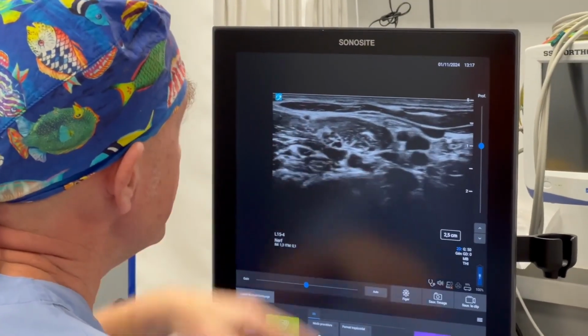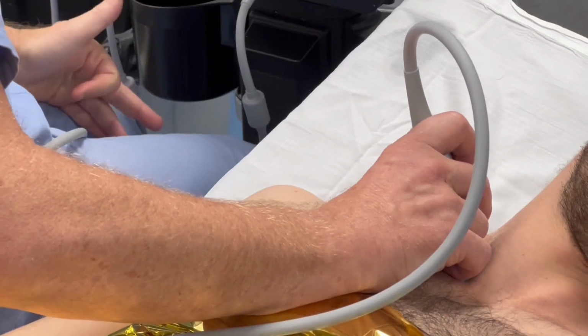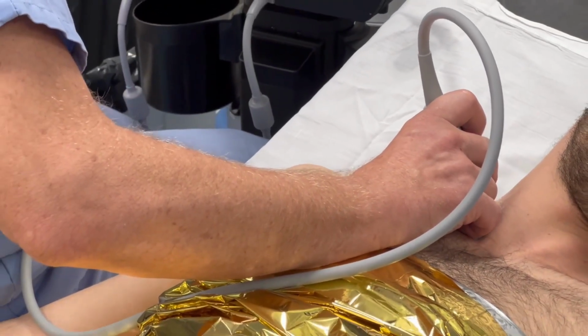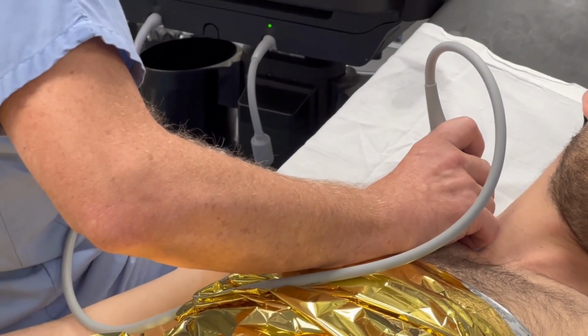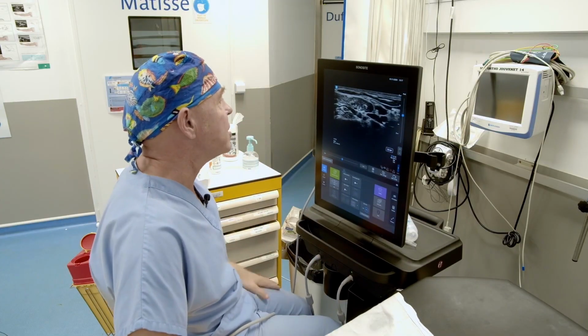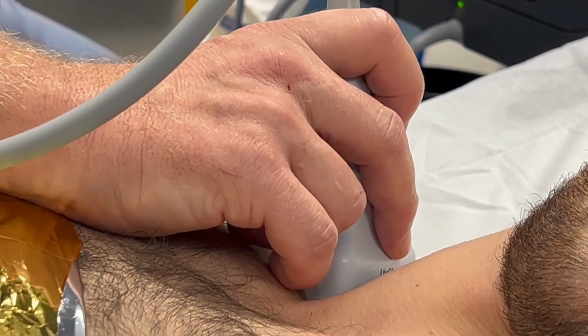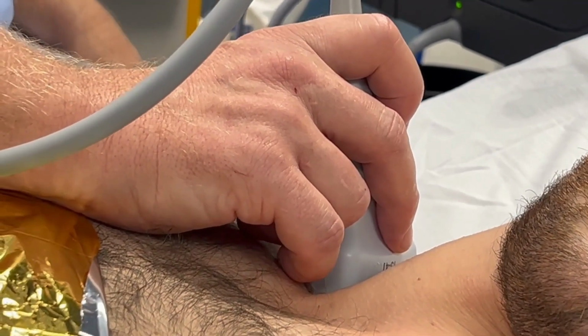Now, what's also important is that you can combine this block, for example, with a PEX. Why a PEX? Simply because you can cover part of the intercostobrachial nerves. Well, these are actually fairly recent concepts. I won't dwell on that, but you can ask me in the comments or through the contact forms. What I meant by that is a bit complicated to explain to you right now.